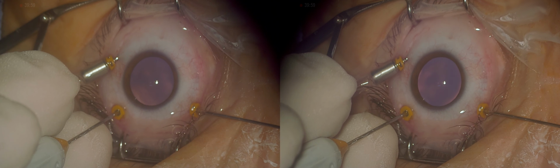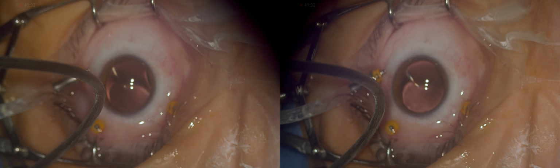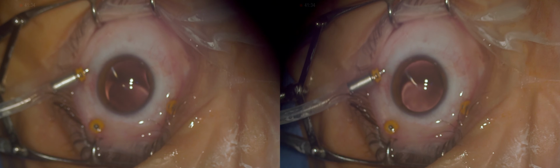More PFC was then injected, aimed at covering the retina, going past the peripheral retinotomy. Image displays peripheral nasal laser as a protection barrier peripherally. Time for silicone oil perfluorocarbon direct exchange to remove PFC and fill the eye up with silicone oil.